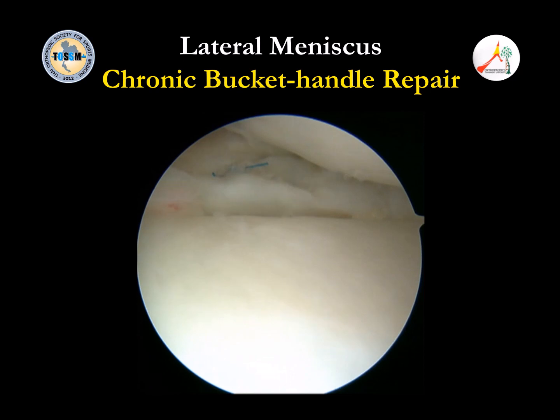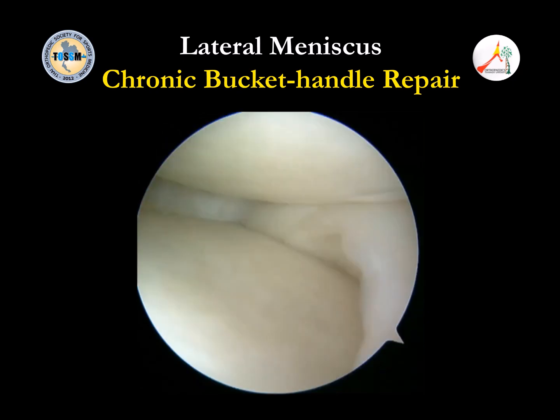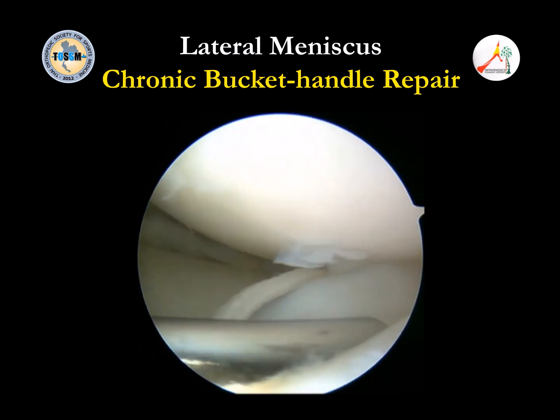Actually it's quite difficult. It took me nearly 1.5 hours for this meniscal repair, but I think I did my best. He's very young, 19 years old, with a bucket handle tear. If you cut the meniscus, that's the end of his knee.